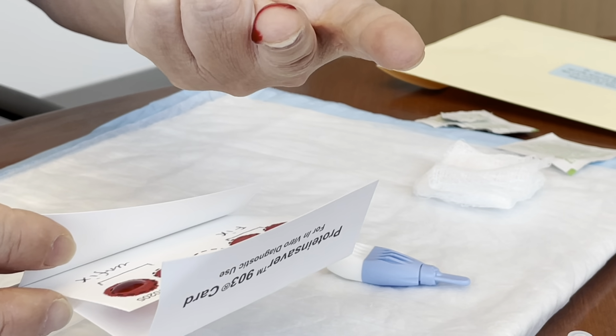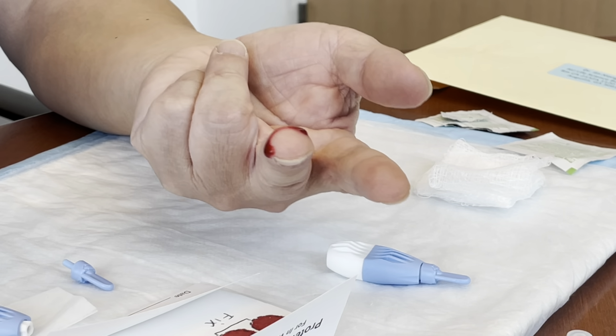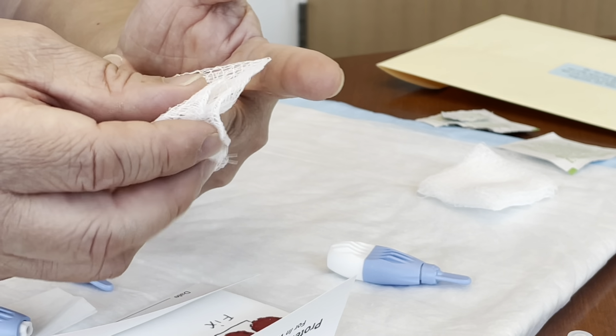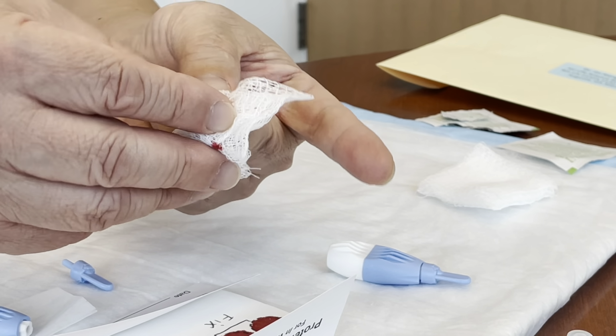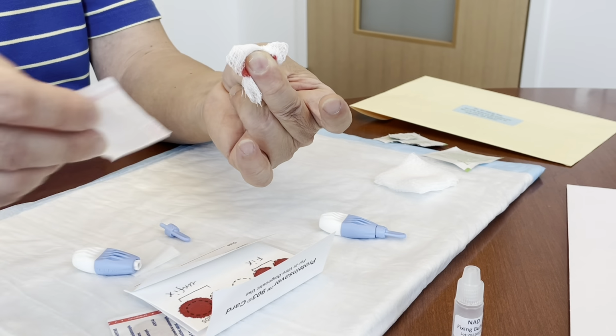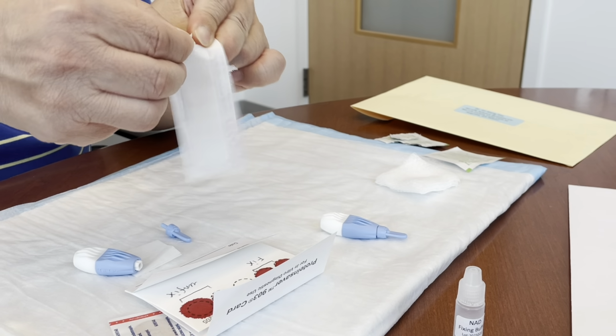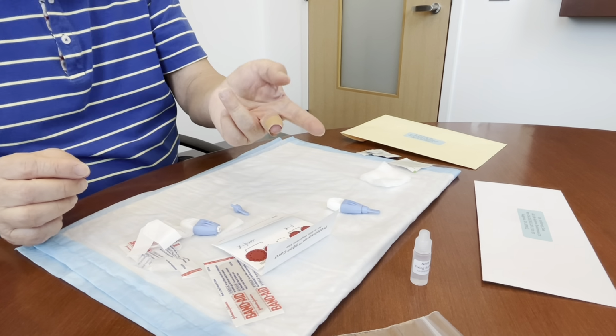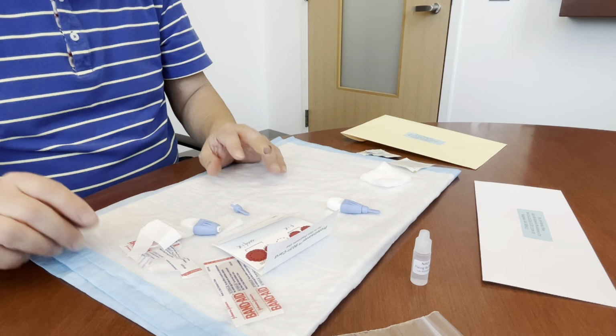When the first 2 circles and the last 2 circles on your card are filled to the edges, press the gauze to your fingertip site and apply steady pressure until the bleeding stops. When you're ready, you can apply a bandage to the site. Your collection is complete.